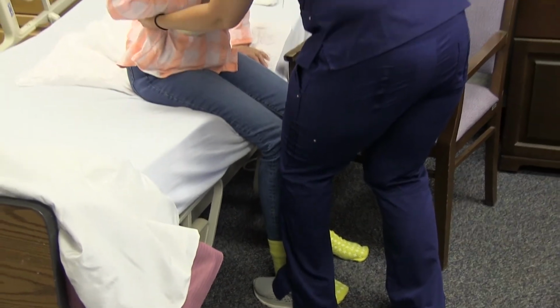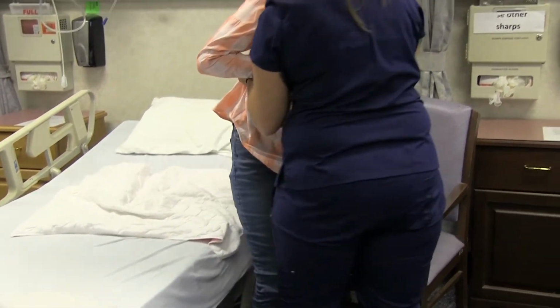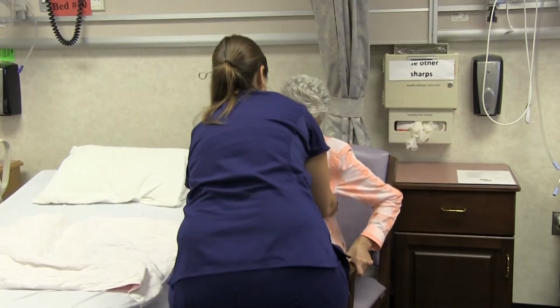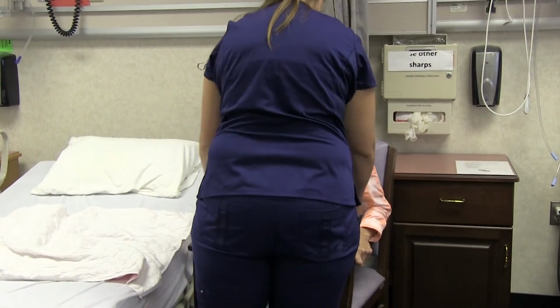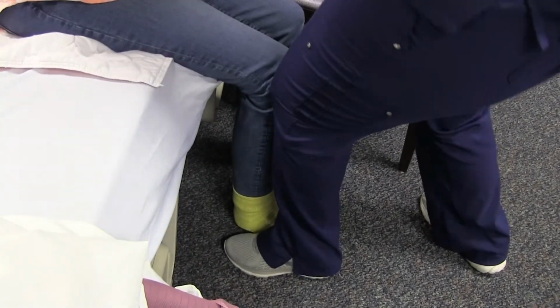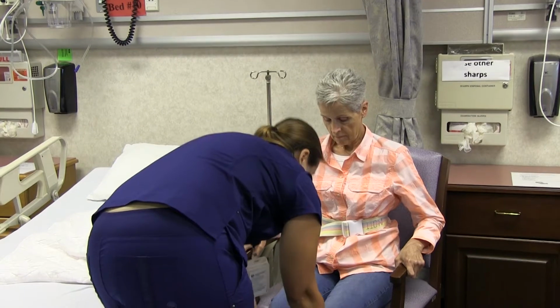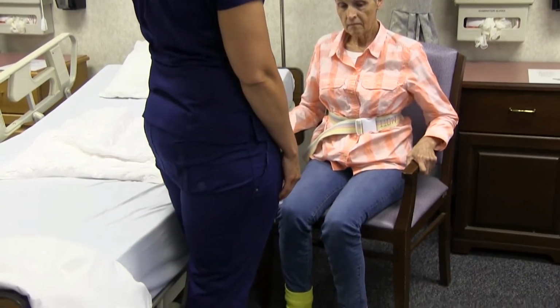Maintain stability of client's paralyzed leg with own knee. Instructs client to anticipate using strong side to reach for armrest on chair support. Pivots and lowers client in the chair, flexing own hips and knees. Assesses client for proper alignment in sitting position and supports paralyzed extremities.